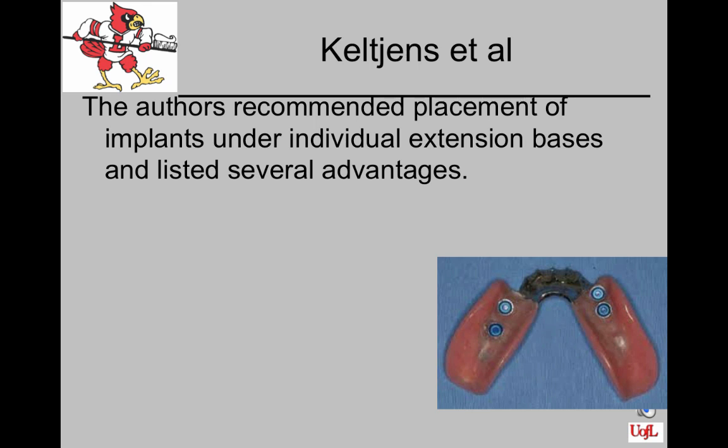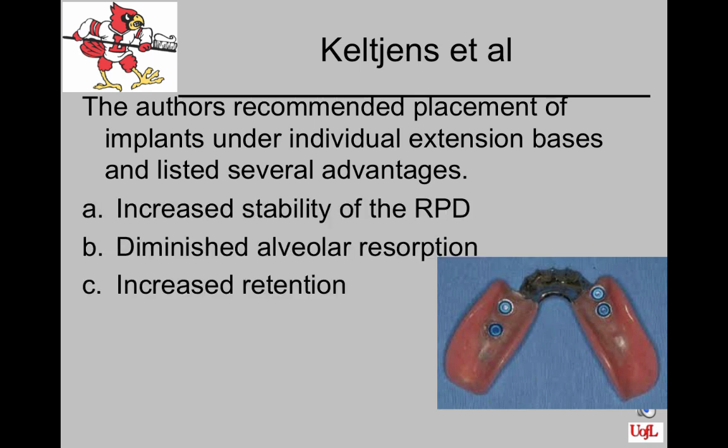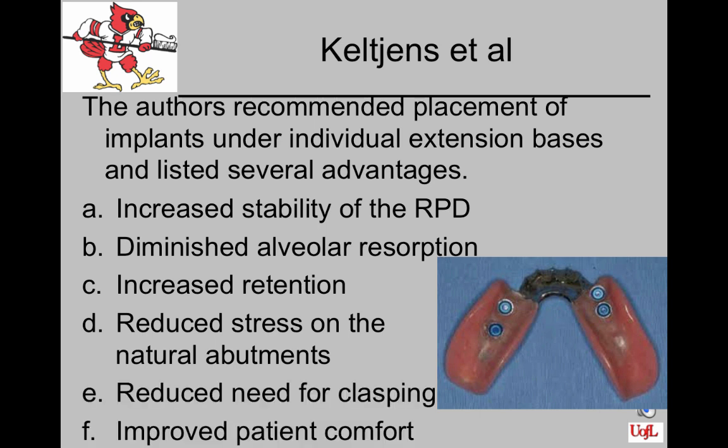The authors of a research study recommended placement of implants under individual extension bases and listed several advantages, those being increased stability of the RPD, diminished alveolar resorption, increased retention, reduced stress on the natural abutments that remain, reduced need for clasping, and improved patient comfort.